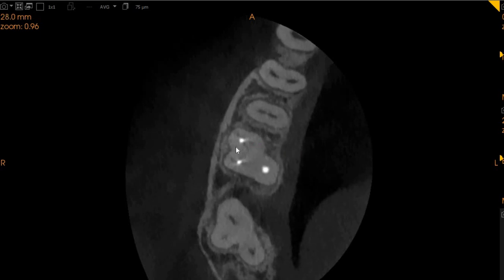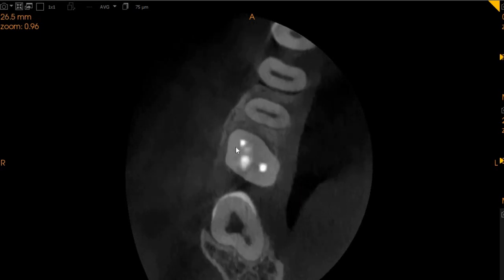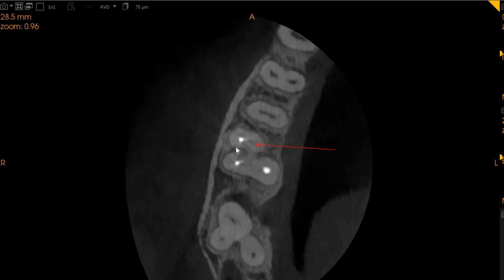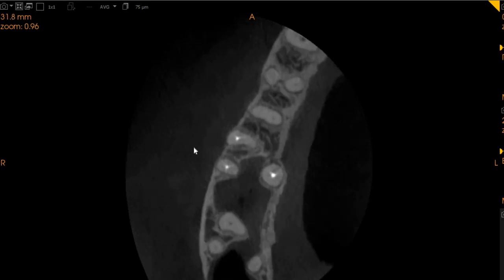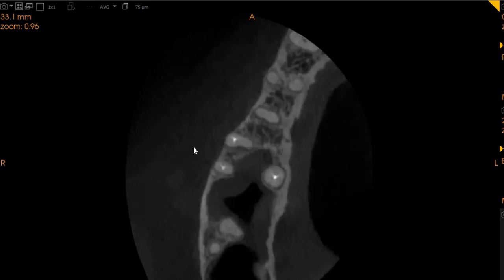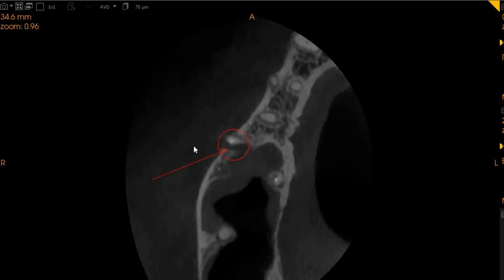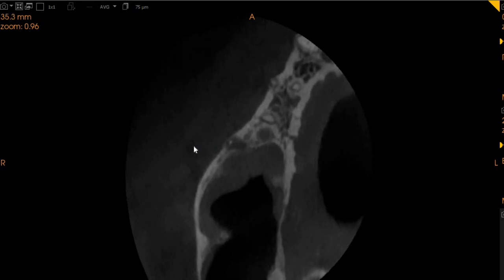The MB2 is definitely present and can be seen in multiple segments over the axial view, and hence this is something that needs to be located. On the axial view we can show the very apical radiolucency, majorly associated with the MB2 buccal route. If there are further questions, please feel free to reach out to our team. Thank you.